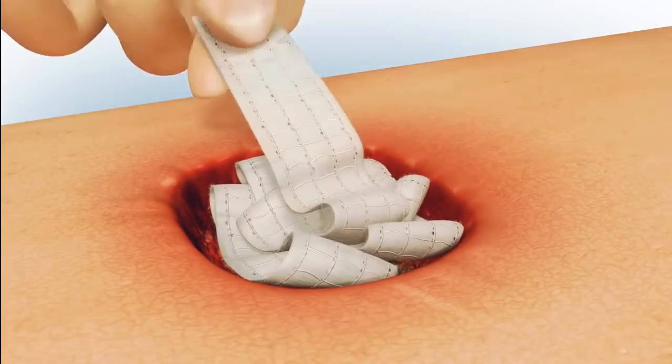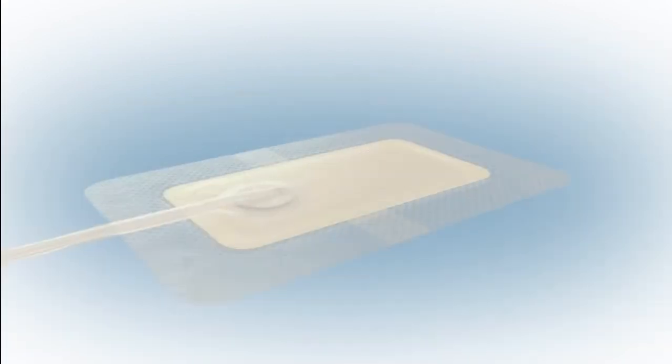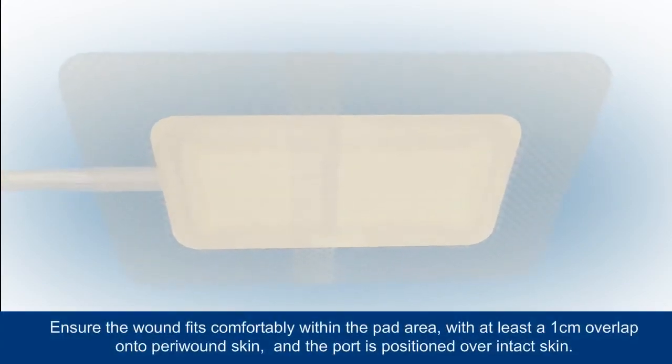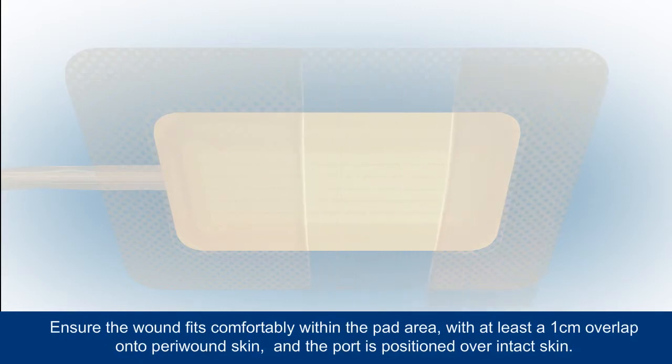Partly remove the backing from the dressing and position it over the filled wound. A moderately exuding wound should take up no more than 25% of the pad area, with at least a one centimeter overlap onto the peri-wound skin.